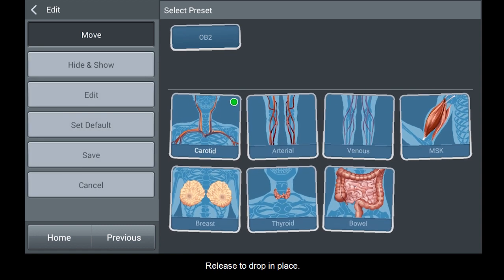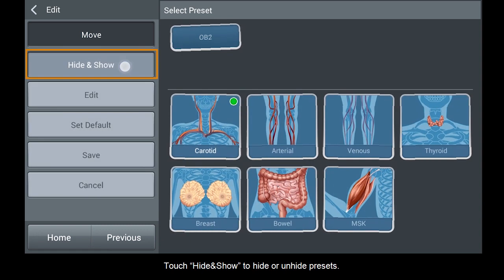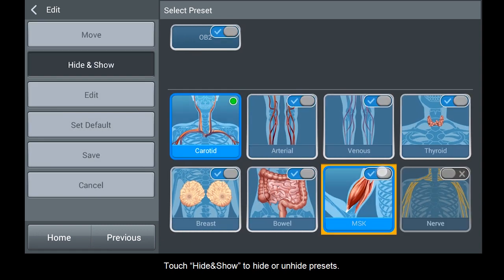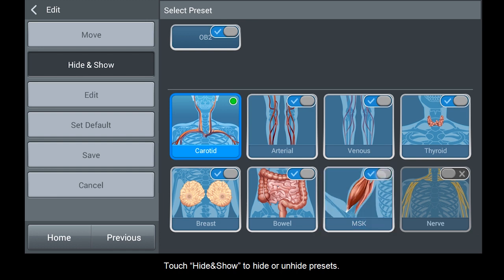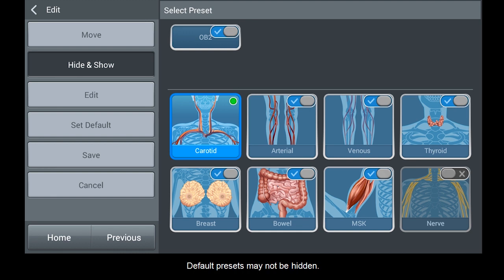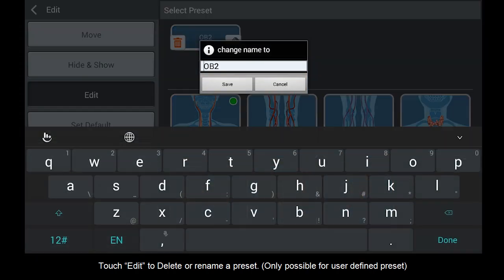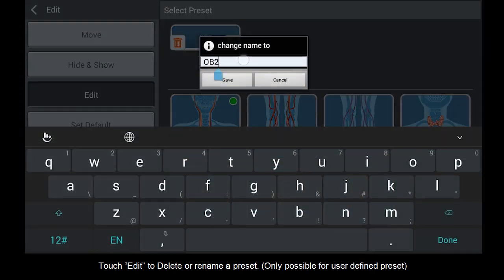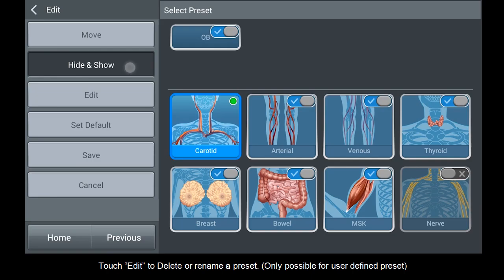Release to drop in place. Touch Hide and Show to hide or unhide presets. Presets that are hidden will not be displayed on the screen when selecting Transducer Presets. Default presets may not be hidden. Touch Edit to delete or rename a preset — only possible for user-defined presets.